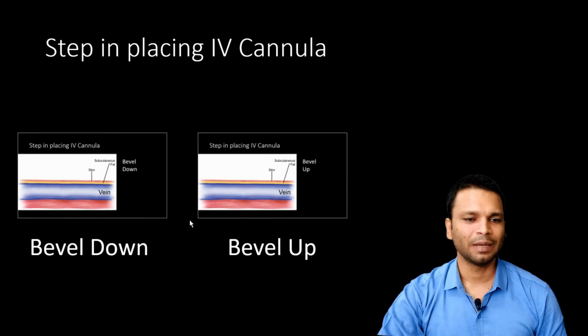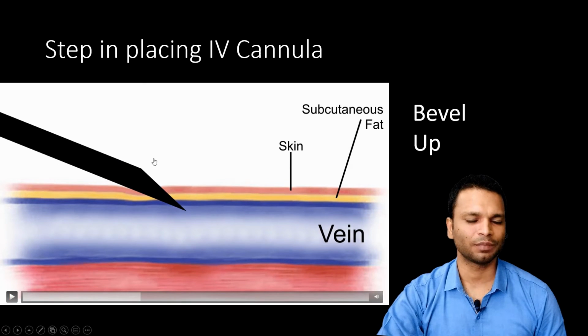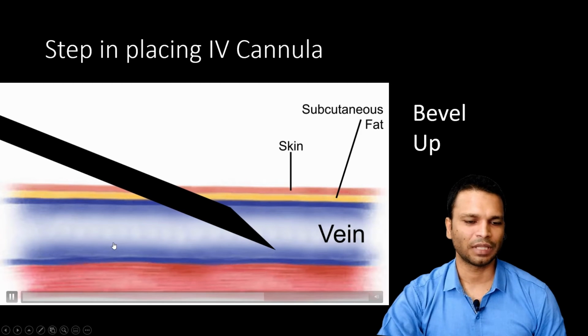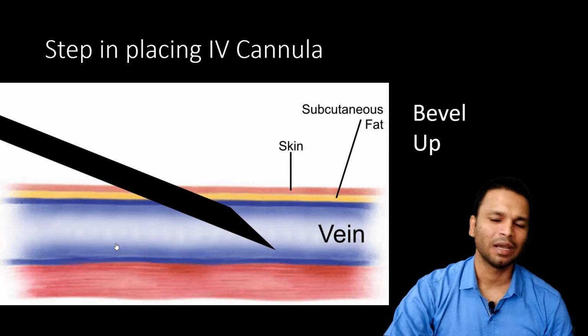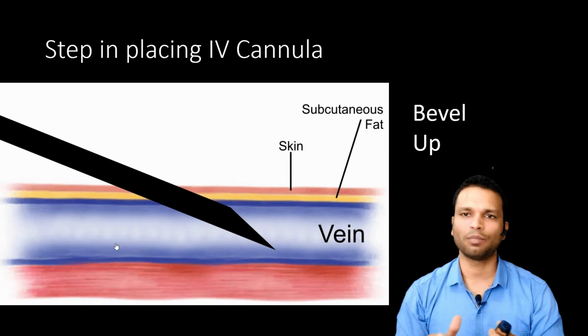Then we have the bevel up. In this you can see the bevel is facing away from the skin and it easily enters the vein without any discomfort to the patient. Of course there will be some minor discomfort to the patient, but as compared to the bevel down, bevel up is far more comfortable.